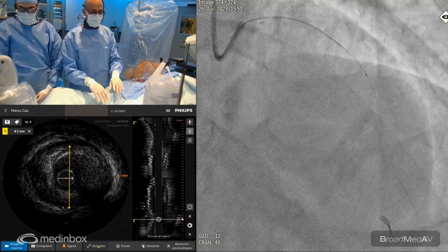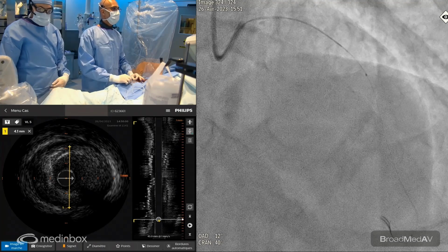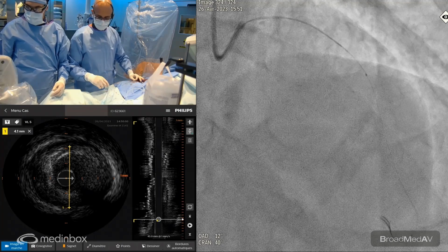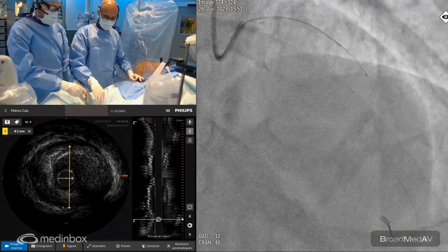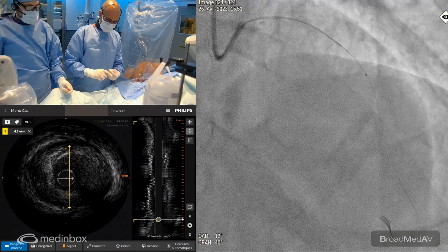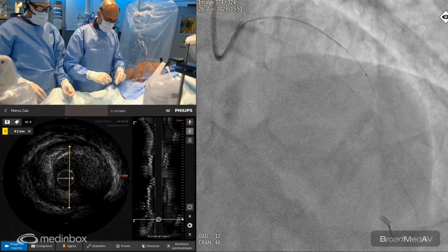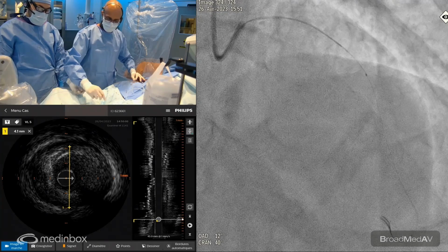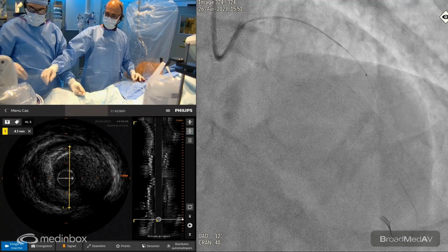Let's take the microcatheter and let's take a 2.5 balloon for trapping. Do you have any 2.5 balloon, old 2.5 balloon? So the safest way, in my opinion, is to deliver a workhorse distally and have a microcatheter. Since we did the IVUS first, the microcatheter wasn't uploaded. So now we'll perform trapping of the wire to be able to bring up the microcatheter safely.